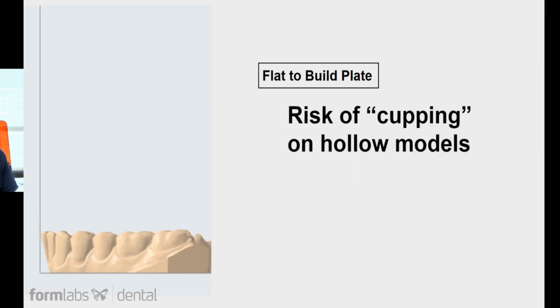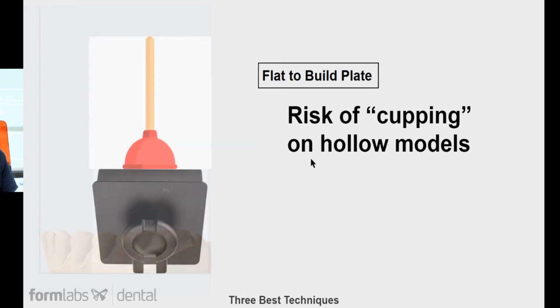Last point I'll make in this video is flat to build plate has risks of cupping on hollow models. What does that mean? So the models I've been showing in this video are solid, or they're solid parts. They don't have any hollow features to it. But some parts have hollow features, and what happens is as it prints, it almost draws like a cup, like a suction cup or a plunger.